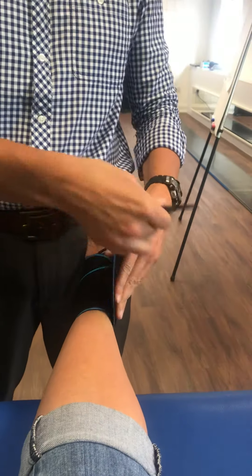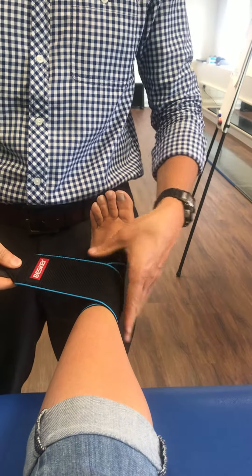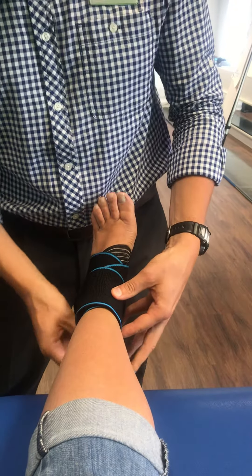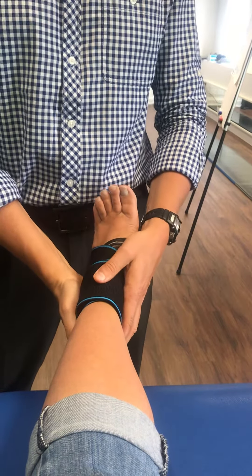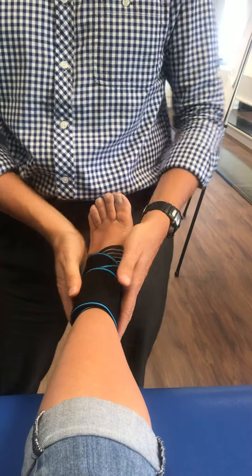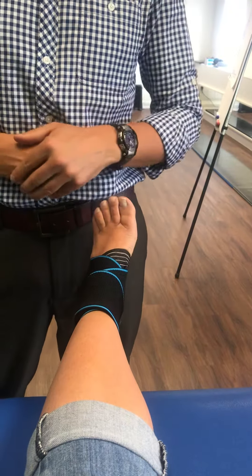Then we just come round again. We don't need to keep tension on at this point — the strapping is just to lock that tension in at that initial area. You can put the velcro pretty much wherever is comfortable for you, and that should have provided some support inwards and helped support the function of the arch and the inside of the leg.